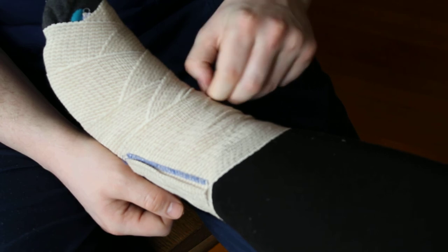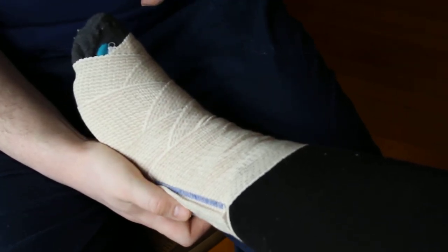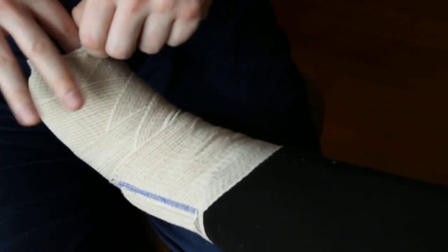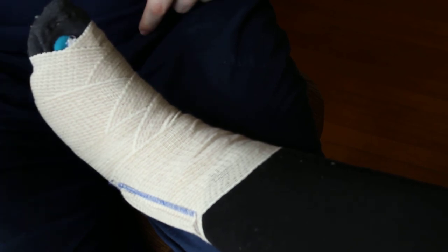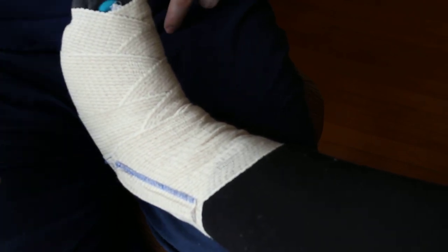It should not be painful. If it is, you may have to take it off and redo your wrappings. You want to check for tightness at the bottom and make sure it's not too tight. You don't want it to restrict your blood flow, so you're going to be checking for capillary refill at the toe.